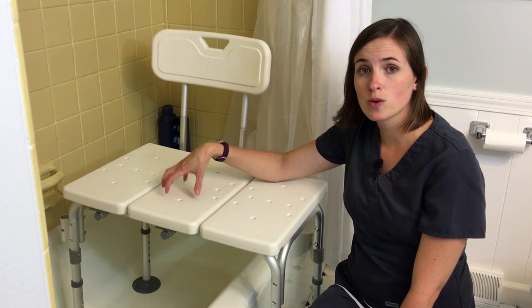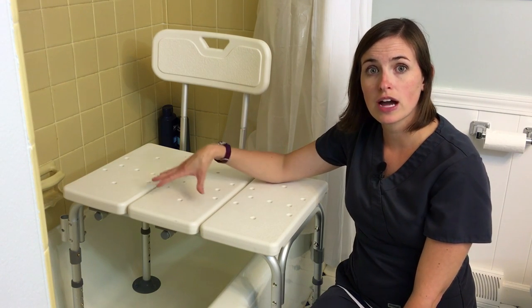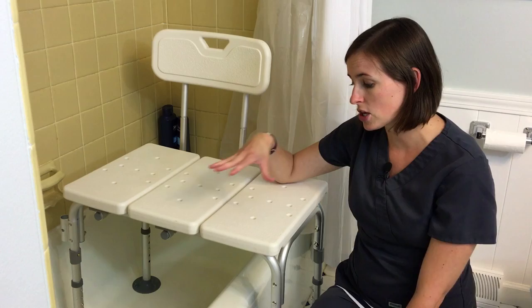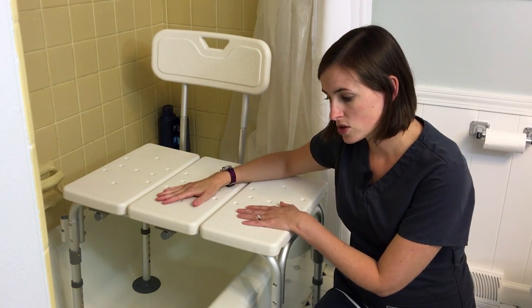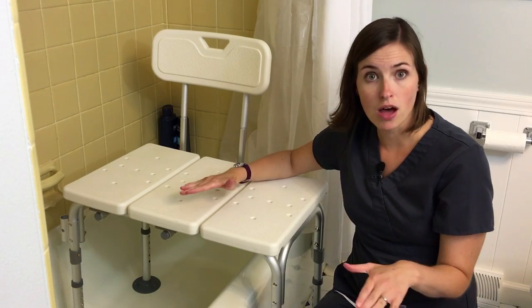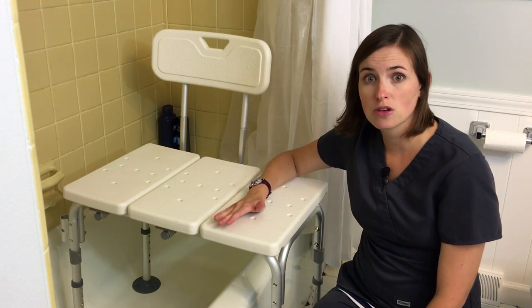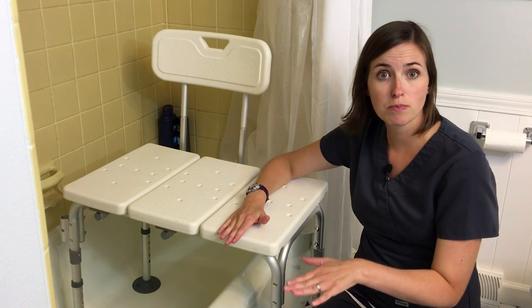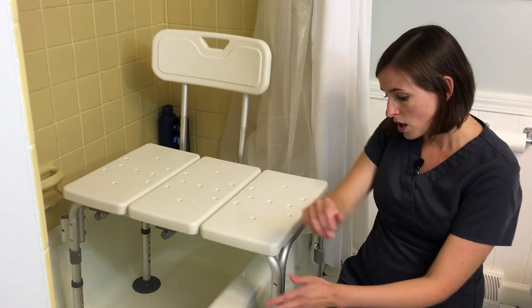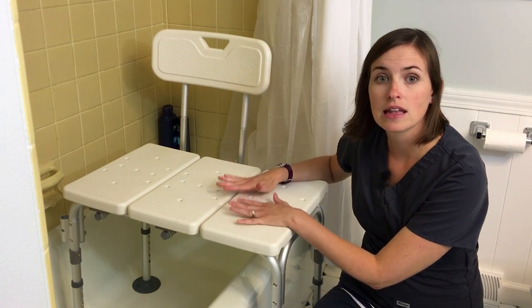As you can see, this one has already been set in place. Special things to consider when you're actually putting these in place is you want to make sure that you've checked the level. In this particular tub and floor, they're the same height, so I did not have to adjust the legs to be different heights, but frequently you'll find that the tub floor may be higher or the actual bathroom floor might be slightly higher. So these legs can be adjusted to accommodate that, because you want this to be as level as possible.